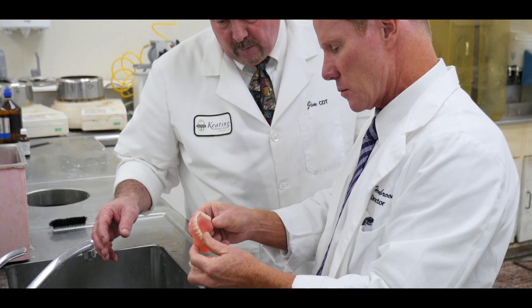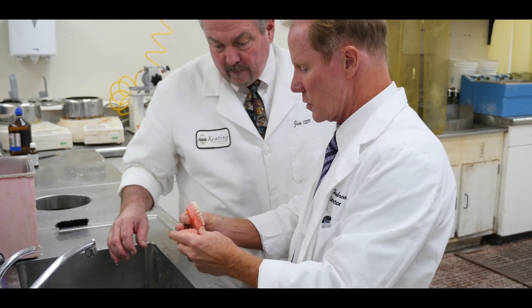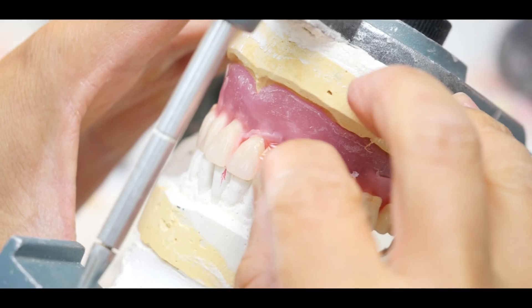We have the KDA economy or basic denture, and then we have one in the middle — that's our premium denture. It uses the Ivocap denture finish as well and the Ivoclar blue line of teeth. It is probably our most popular denture right now. The difference between the premium and the Ultra is the Ivocap system and basically the quality of the teeth. They're all good quality teeth, including the economy tooth.